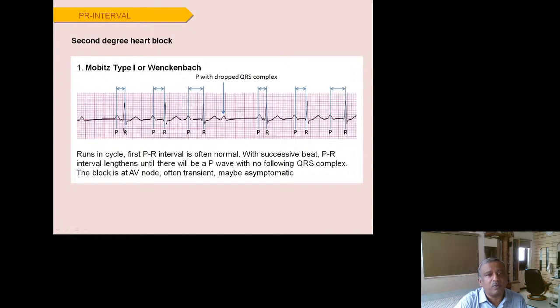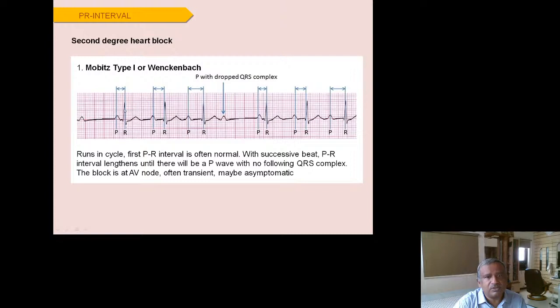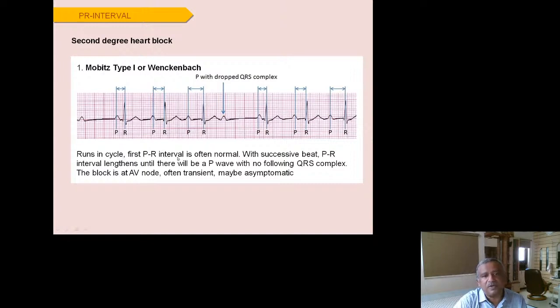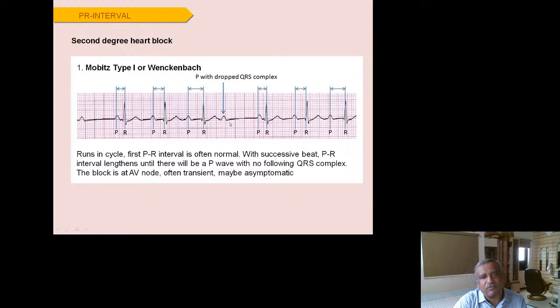Mobitz type 1 (Wenckebach phenomenon): the PR interval progressively lengthens with each beat until there is a P wave with no following QRS complex, then the cycle repeats. This occurs because AV node delay increases until the AV node becomes so refractory it fails to transmit the impulse to the ventricles. The block is at the AV node level.